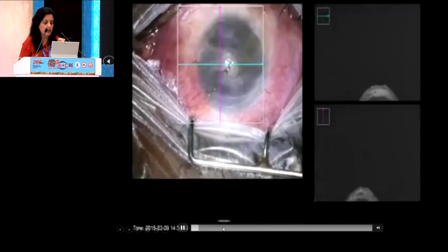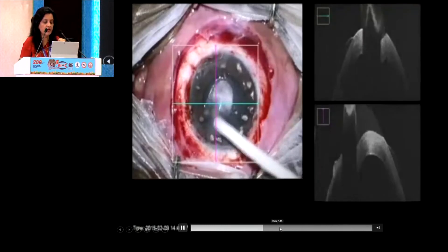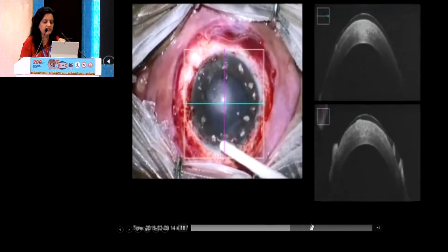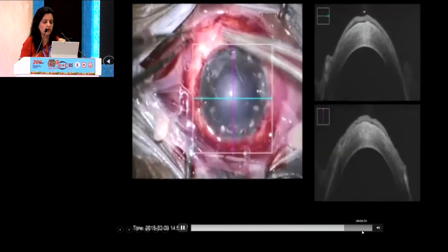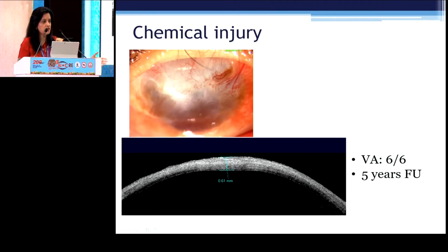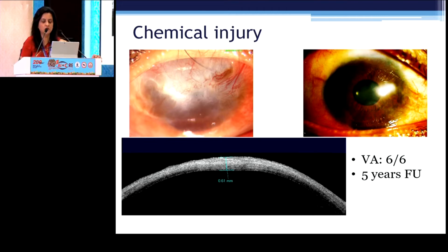When you are doing a layer-by-layer SLET procedure or a layer-by-layer corneal transplantation procedure, just by comparing it with the adjacent part of the cornea, you know at what level you are dissecting — without having to imagine it. This case was referred to us for corneal transplantation, and we did a SLET procedure using the intra-op OCT microscope and it cleared up. You didn't have to do a corneal transplantation procedure because you knew at what level you were dissecting after removing the pannus.